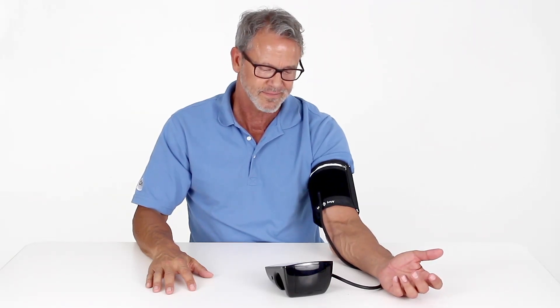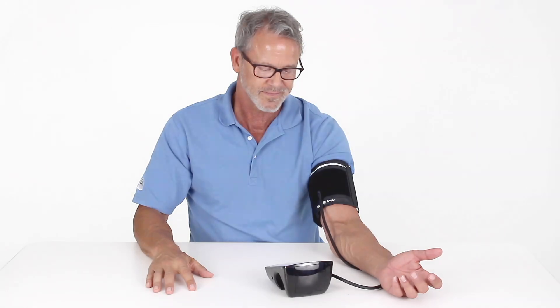Be sure to take your measurements at the same time each day for consistency. Taking measurements at different times will result in inaccurate readings.